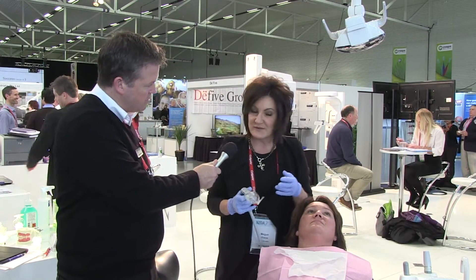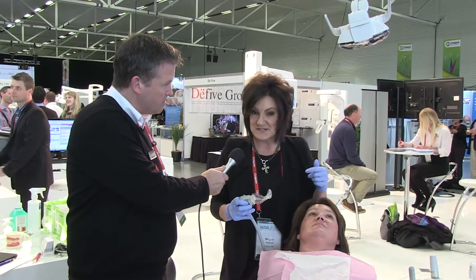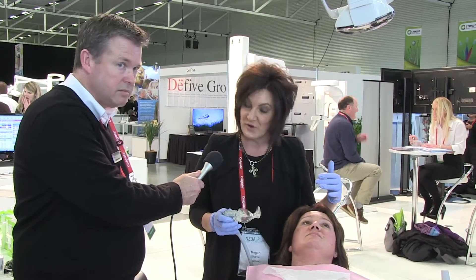Sure, it's a really new innovative product and it's probably about to change the face of dentistry. It gives a whole new level of control of the oral environment.